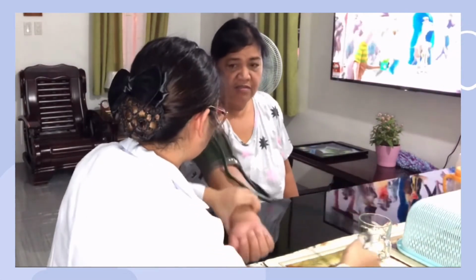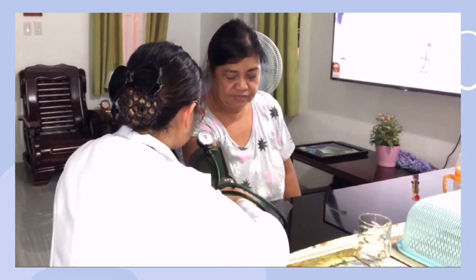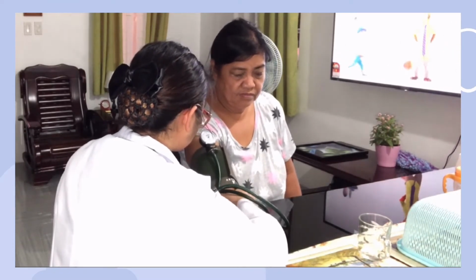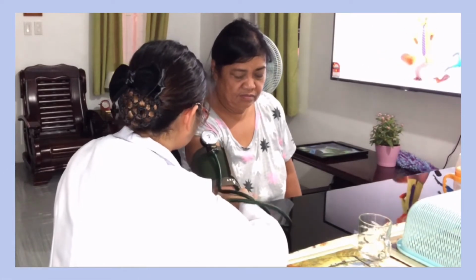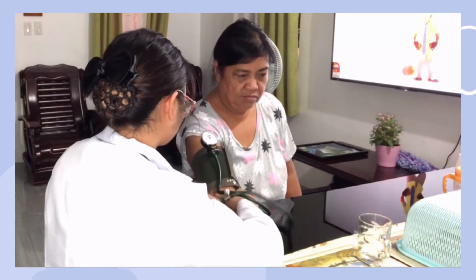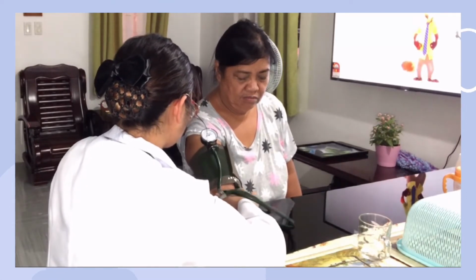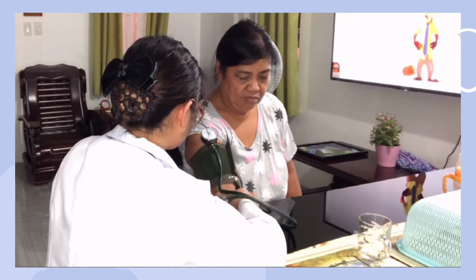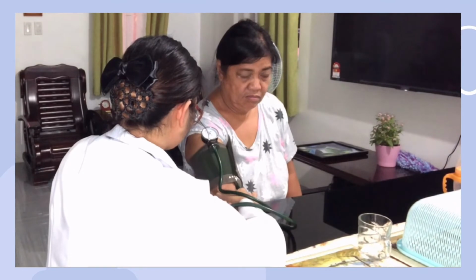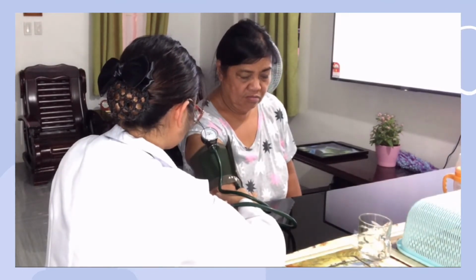If this is the client's initial examination, perform a preliminary palpatory determination of systolic pressure. Palpate the brachial artery with the fingertips. Close the valve on the pump by turning the knob clockwise. Pump up the cuff until you can no longer feel the brachial pulse. At that pressure, the blood cannot flow through the artery. Note the pressure in the sphygmomanometer at which pulse is no longer felt. Release the pressure completely in the cuff and wait 1 to 2 minutes before making further measurements.